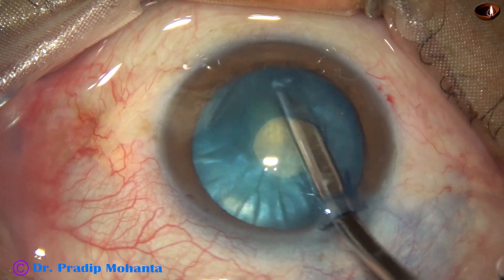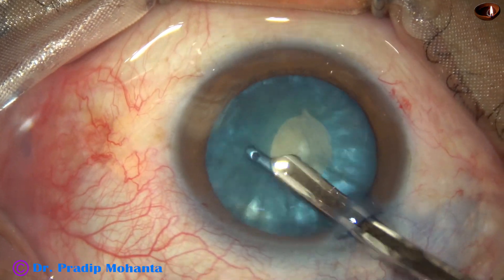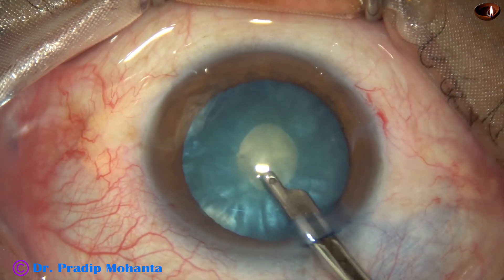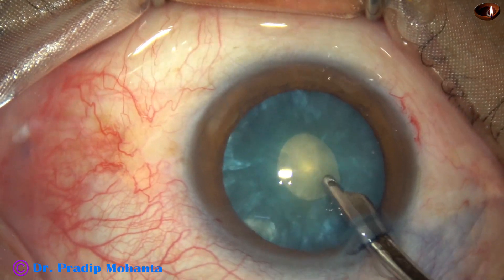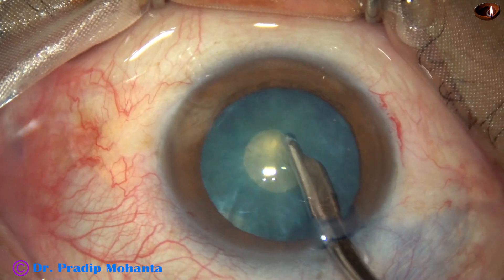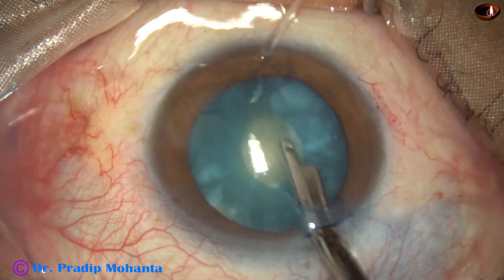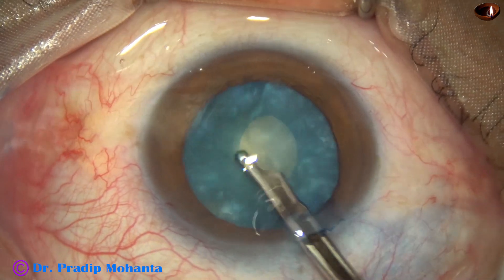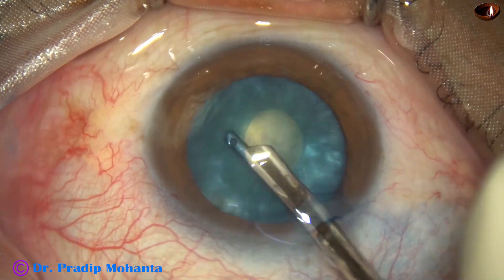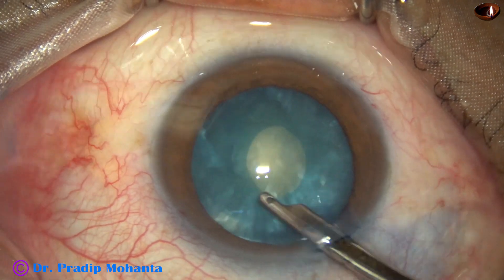Some cortical matter is removed. Very nicely, the cortex is removed. The nucleus is rotating by this time. A lot of cortical matter has come out, and the intralenticular pressure has gone down.